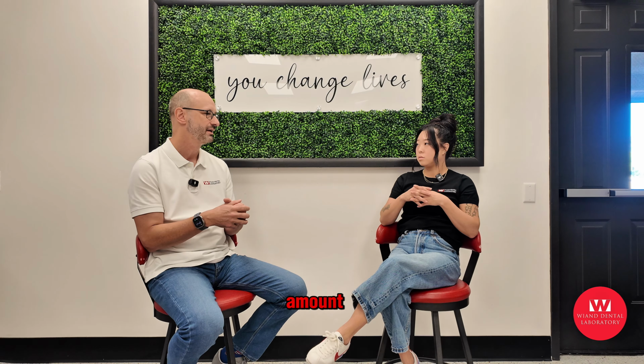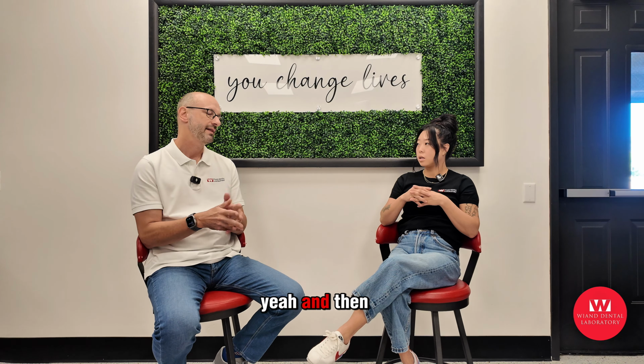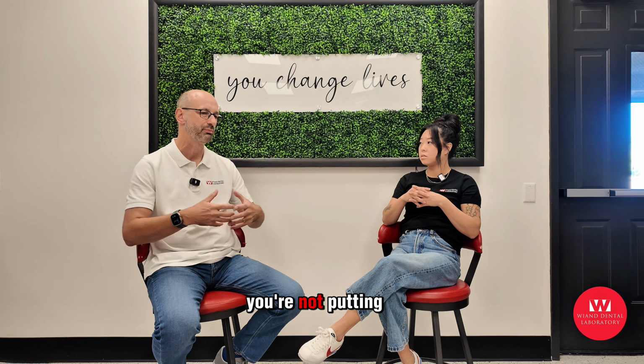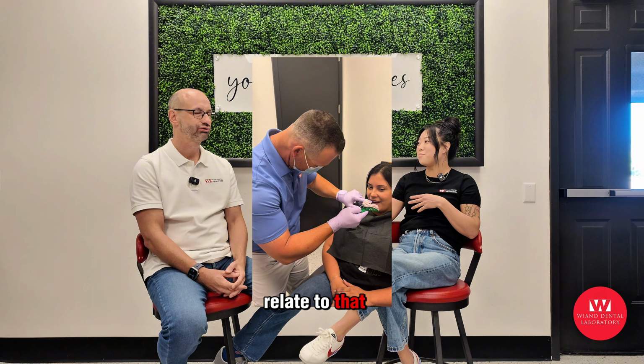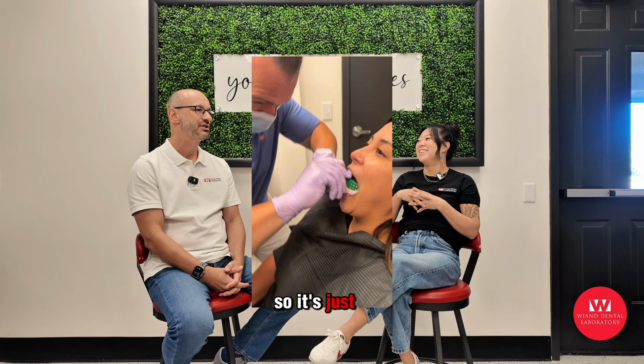Totally. And then same with the full arch FP3, all on 4. We can compress tissue an exact amount, develop whatever contours you want on that tissue more precisely than a chairside conversion. And then temp to final, it's just way easier to take records. You're not putting huge impressions in the mouth. Patients not gagging all over the place. And we all know people can relate to that. So it's just a way cleaner, way more efficient workflow, less steps, much more control over the final outcome of the product.